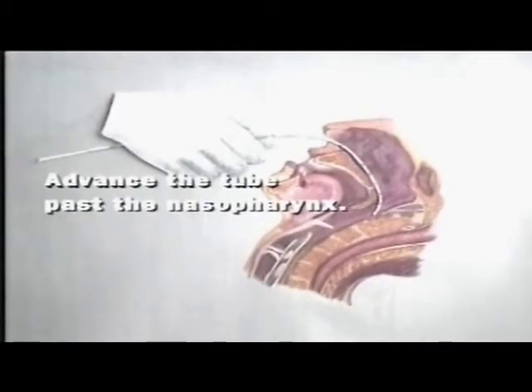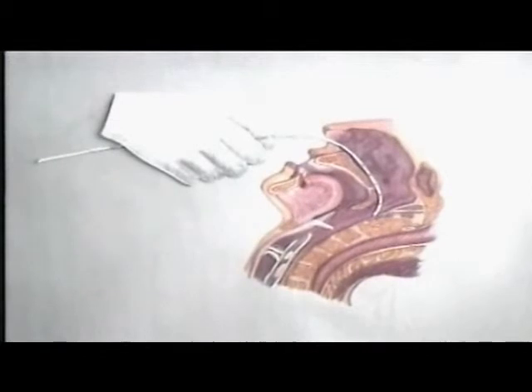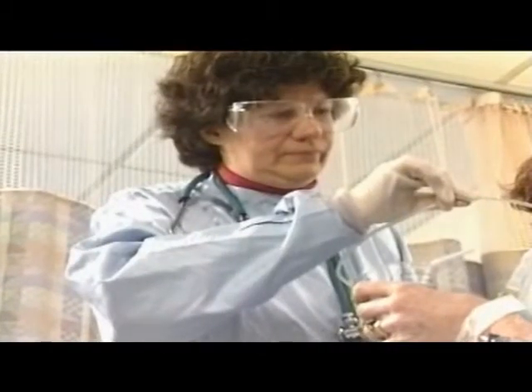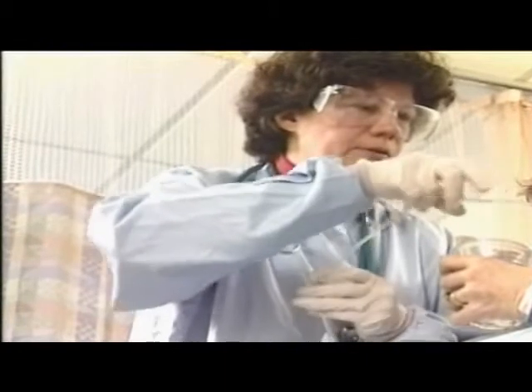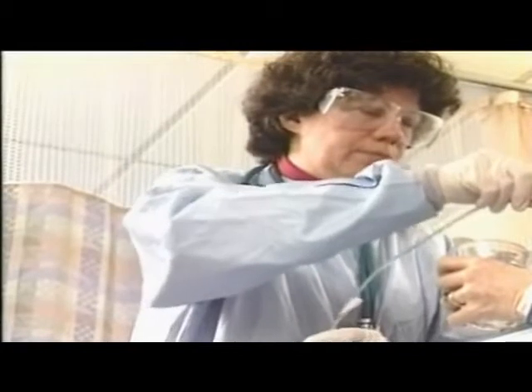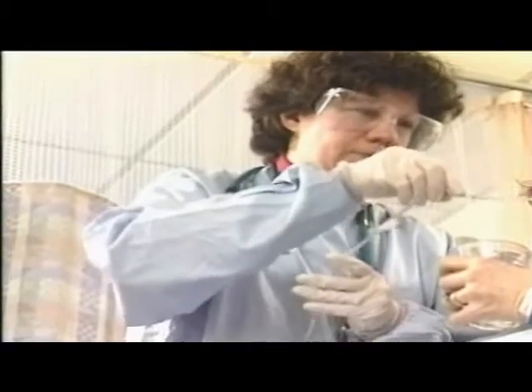Advance the tube just past the nasal pharynx while rotating the tube toward the opposite nares. Pause and allow the patient to rest. Unless contraindicated, ask the patient to take sips of water — swallowing helps to advance the tube. Advance the tube to the correctly measured distance.